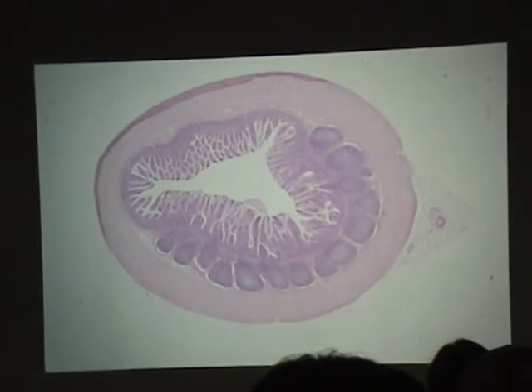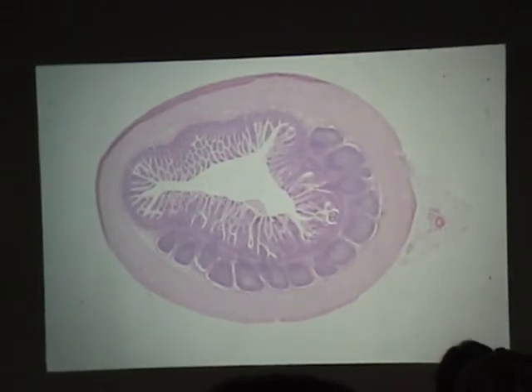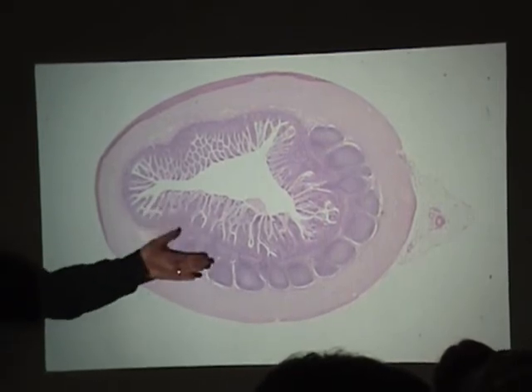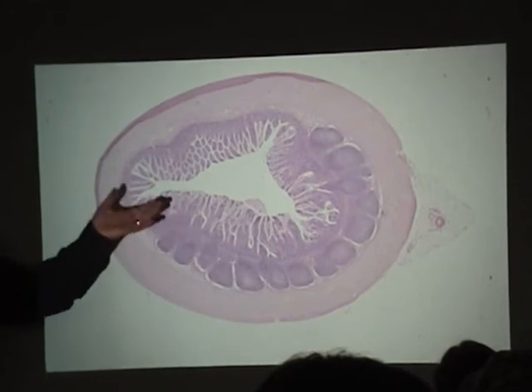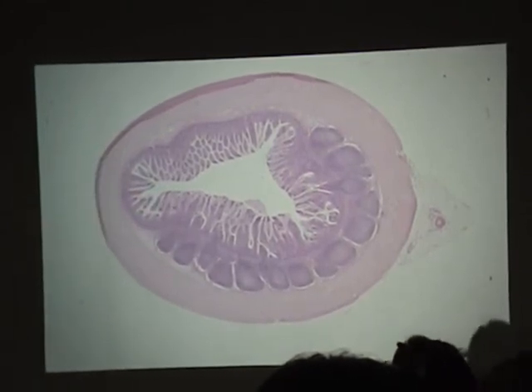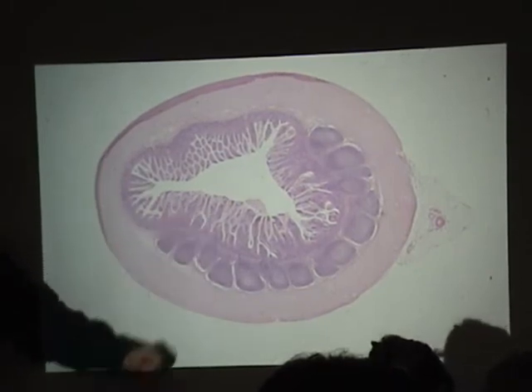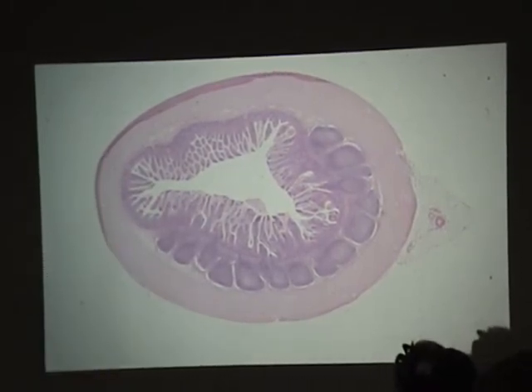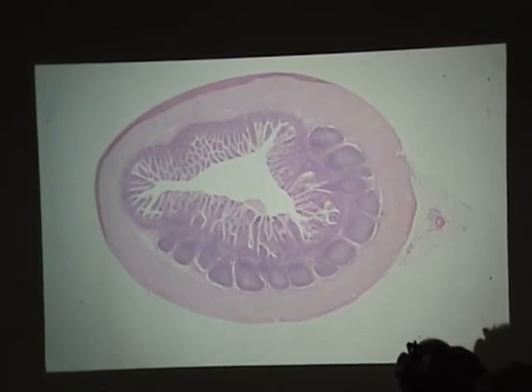Now on the lymphoid tissue — we are clearly looking at Peyer's patches. Peyer's patches will tell us we're looking at what region of the small intestine. And we know it's small intestine because we can see all these finger-like projections which are villi.